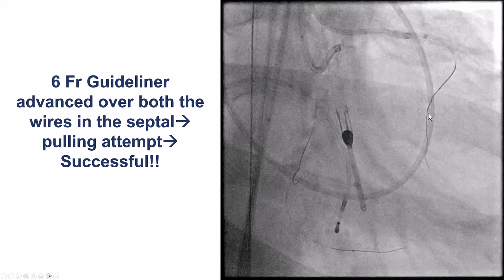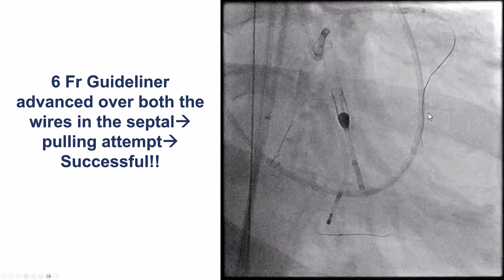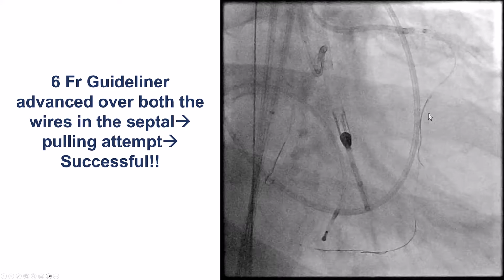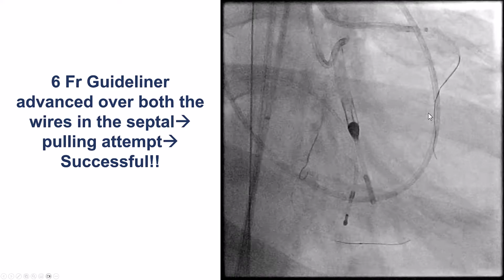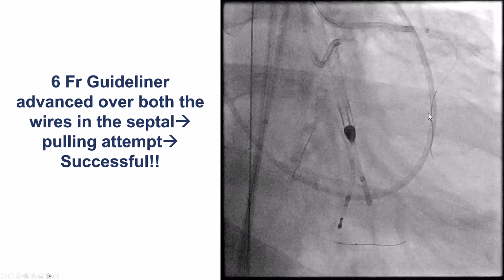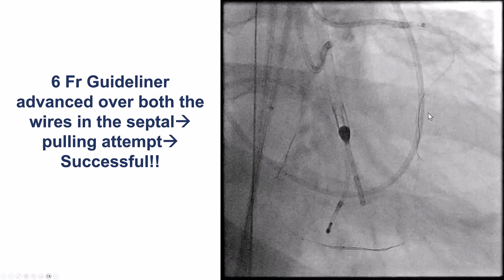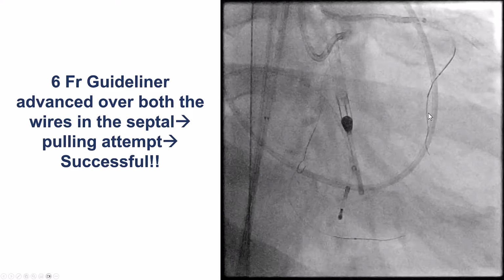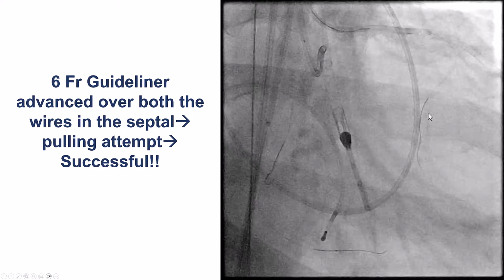And this was now several hours. We had spent several hours inside the cath lab, and we were getting quite desperate at this point, because we knew that if the patient went to surgery, and the surgeons were there and they were willing to take the patient, it would have been very challenging to remove the equipment, and given the patient's low ejection fraction, it is quite likely that he would not have survived the cardiac surgery.